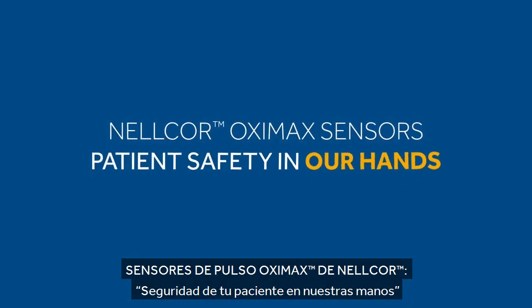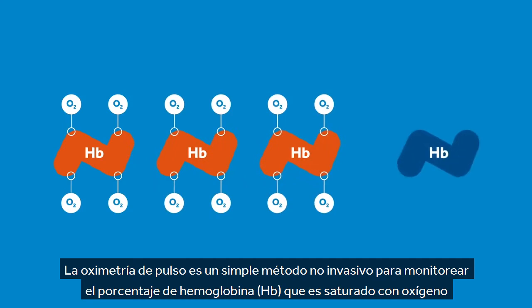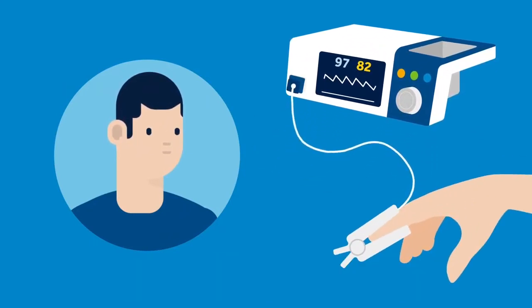This is a pulse oximeter training video. Pulse oximetry is a simple, non-invasive method of monitoring the percentage of hemoglobin which is saturated with oxygen. It is measured by a monitor which analyzes the physiological signal that is captured from a probe.